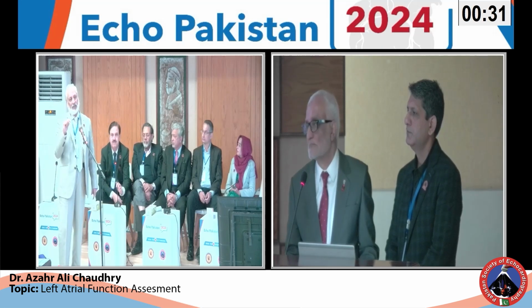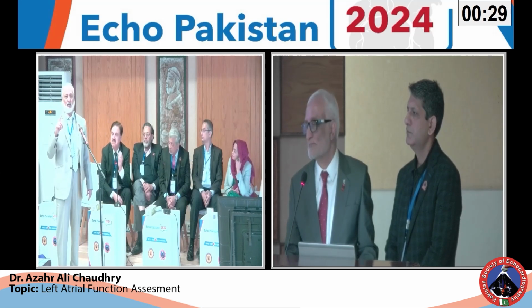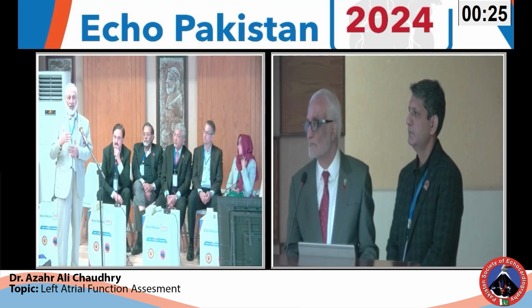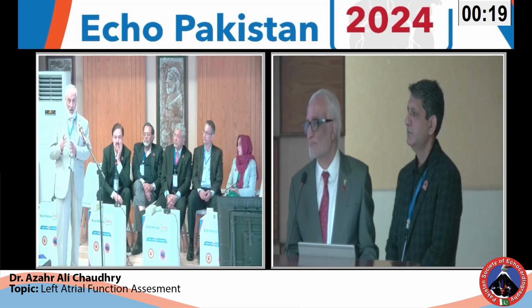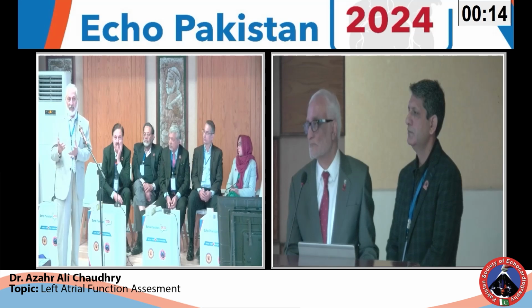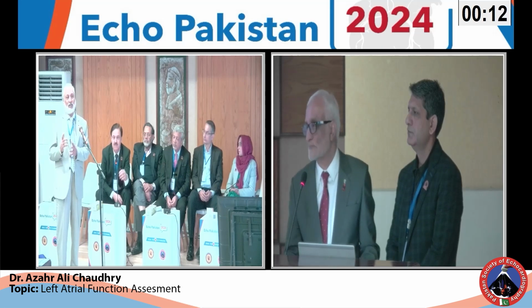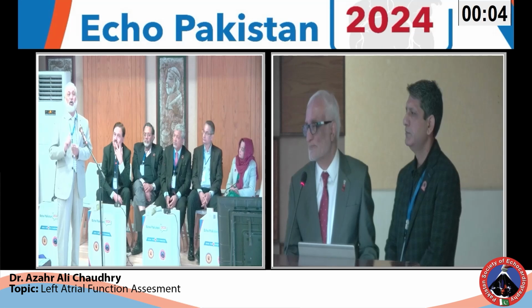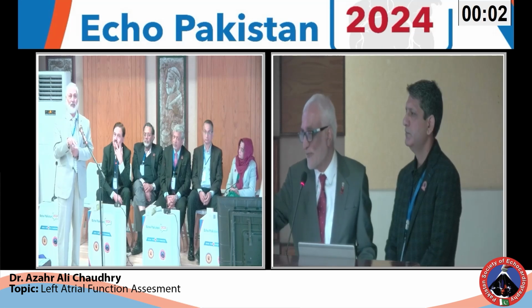Secondly, this LAVI measurement has progressed in our time. Previously, 28 was taken as the normal value, and 34 was taken as a moderately enlarged LA. But now they have changed it. This is evolution. This is science. This is how we adapt to new things. Thirdly, my question is, do you measure LA EF? And what is the value of pre-A LA volume?